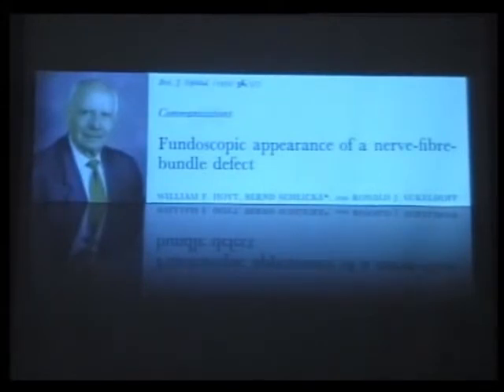Most of what neuro-ophthalmologists are interested in is the retinal nerve fiber layer. And this is so obvious that we tend to forget that actually seeing the retinal nerve fiber layer was not something that happened very long ago. I remember when I was a fellow in Miami, Dr. Hoyt came down to one of the meetings in Key Biscayne and showed his work on the retinal nerve fiber layer utilizing red-free photography, and showed us how it corresponded with visual fields.